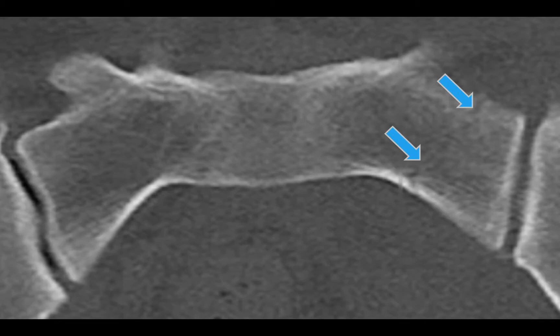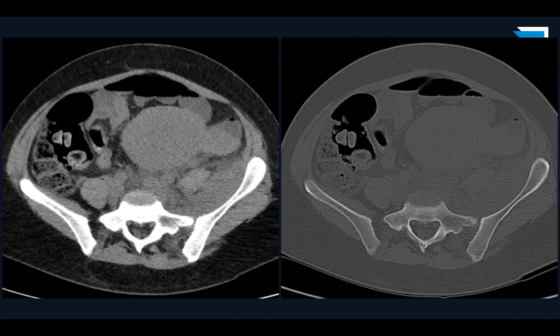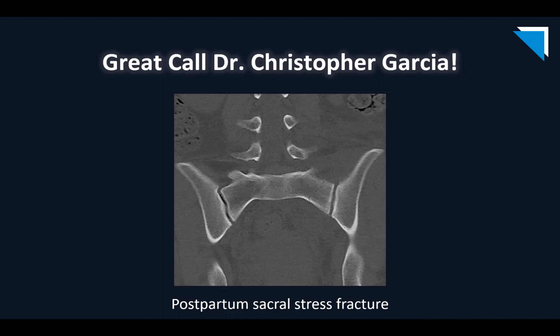Pretty subtle, to say the least. Here's the very zoomed-in image, and you can see the non-displaced left sacral postpartum stress fracture. Excellent call, Dr. Garcia. That fracture was the cause of the diffuse edema and hematoma tracking along the left retroperitoneum, causing the left flank pain. Great call, Chris, on this postpartum sacral stress fracture.